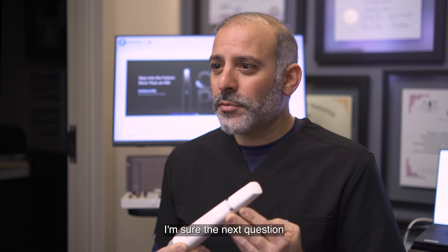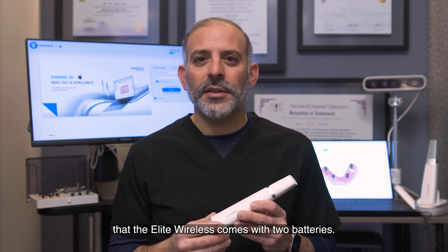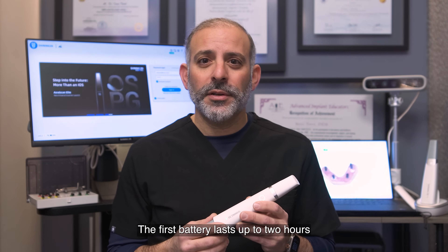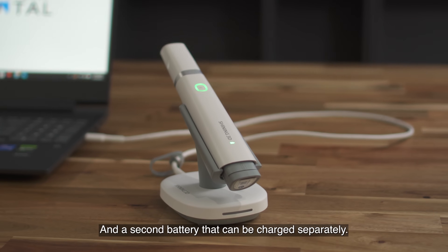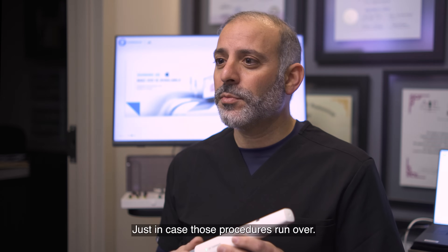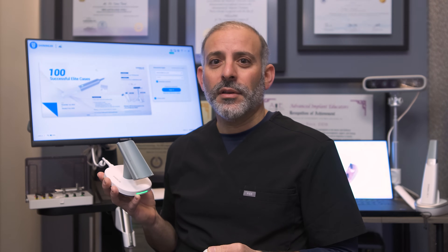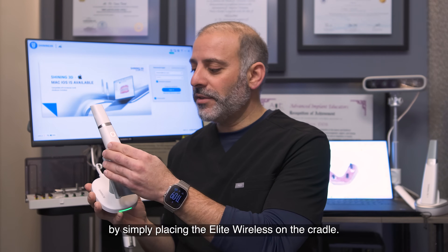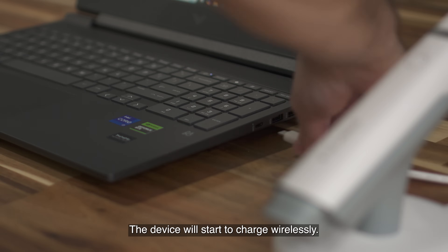The next question is going to be: how long does the battery last? You'll be happy to know that the Elite Wireless comes with two batteries. The first battery lasts up to two hours of continuous intraoral scanning, and a second battery that can be charged separately just in case those procedures run over. The docking station provides the charging — by simply placing the Elite on the cradle, the device will start to charge wirelessly.